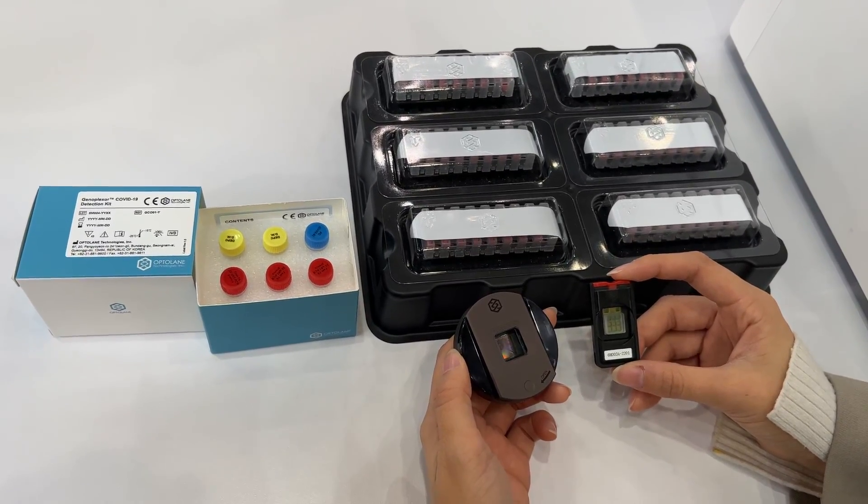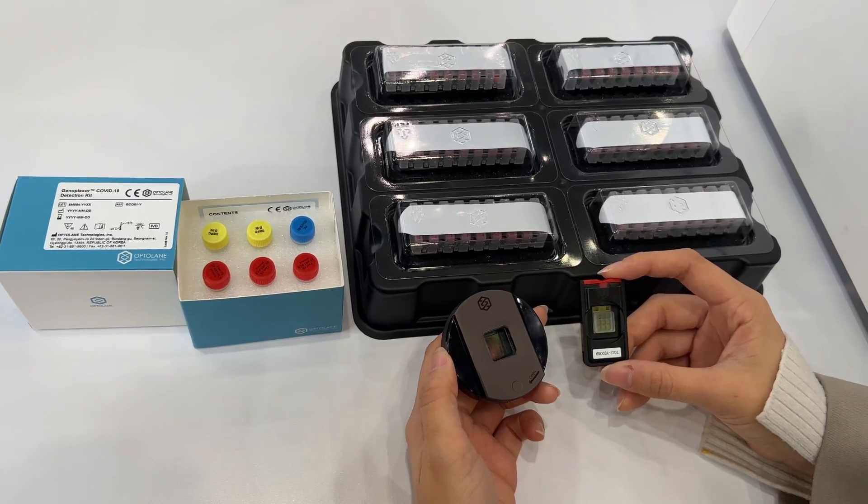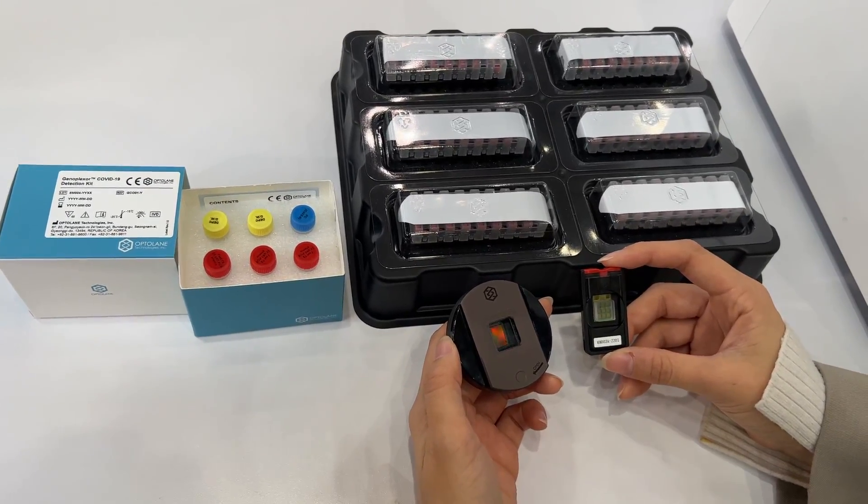May I kindly ask you to introduce your product? What is the name of your product and how does it work?